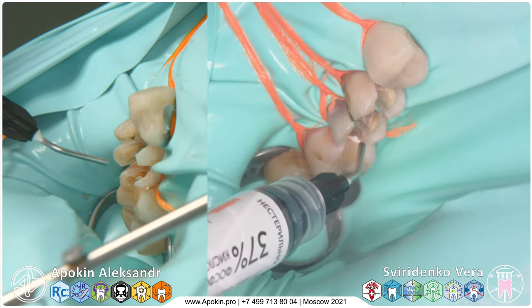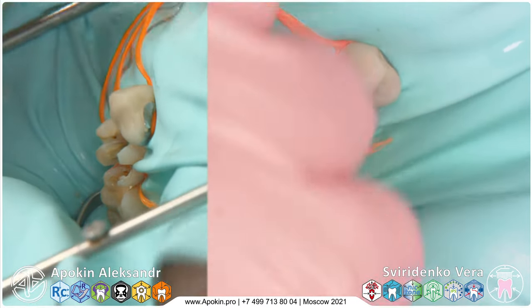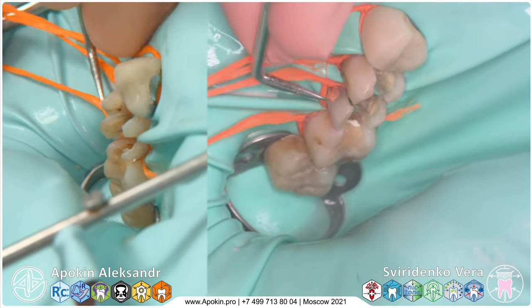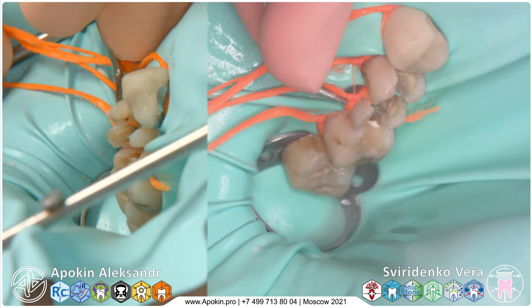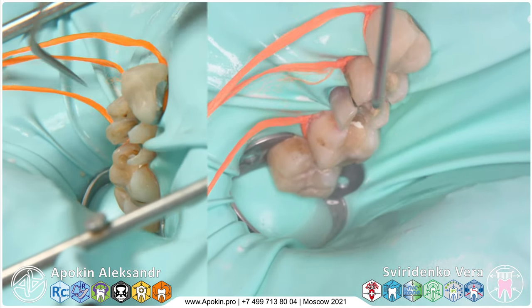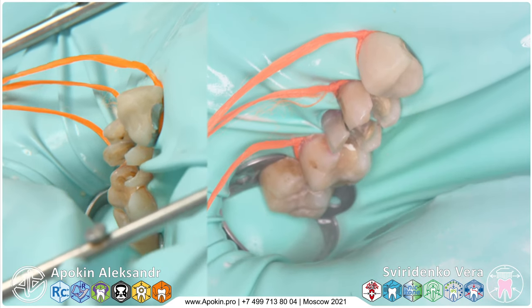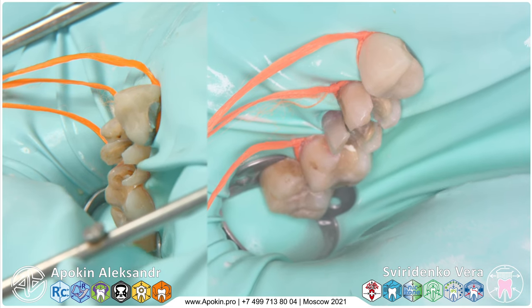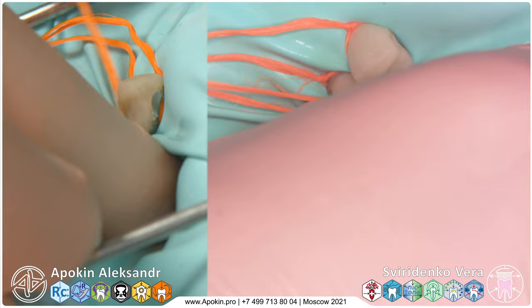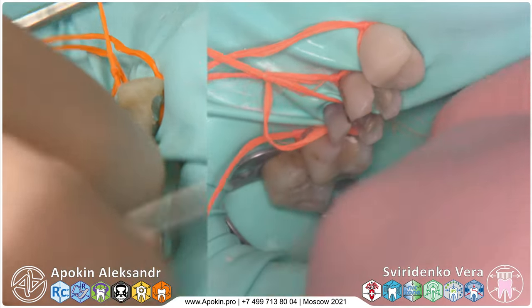I think at this point we can remove some ligatures and replace them because some of them are destroyed. But very good news that our rubber dam plate is still alive. This is normal for me, replacing some ligatures during work, because the goal of these ligatures is preventing destruction of the rubber dam and they did their work well.